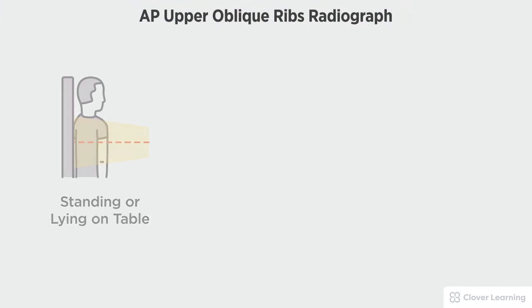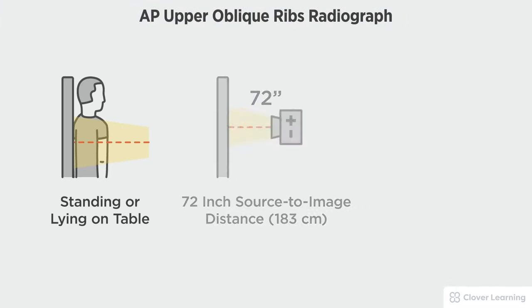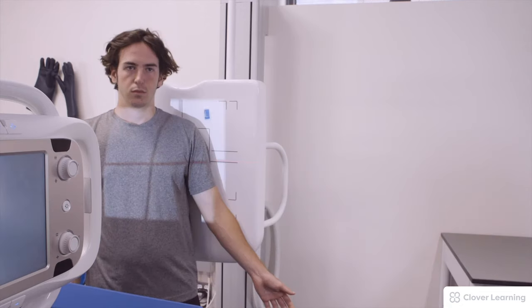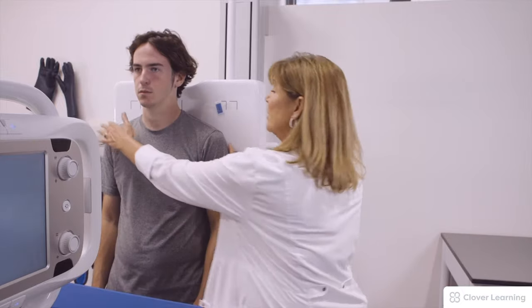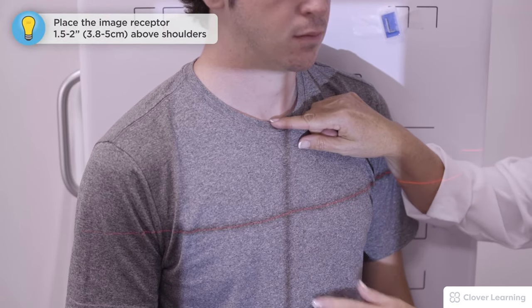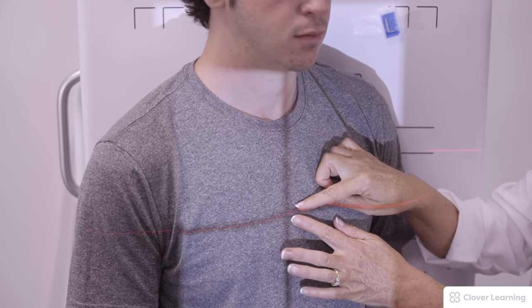In this view we will be demonstrating the AP upper oblique ribs. The AP upper oblique ribs should be performed with the patient standing at the upright bucky or lying on a table with a 72-inch source to image distance and no tube angulation. For the oblique views we again perform above and below the diaphragm. Since the injury is posterior and on the left, we roll the patient to the affected side into LPO at 45 degrees.